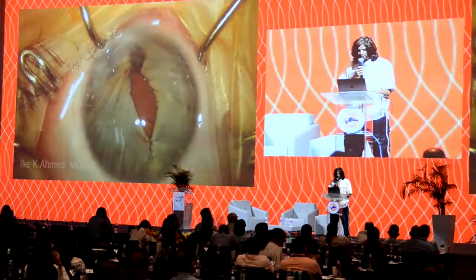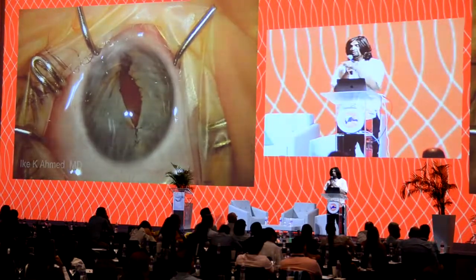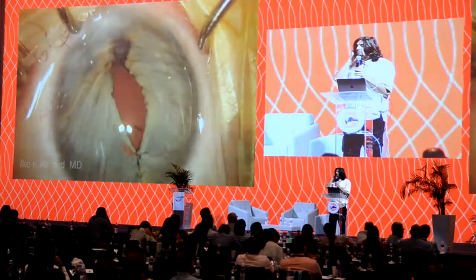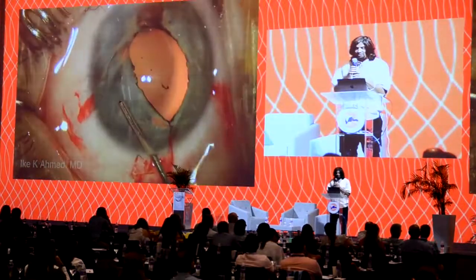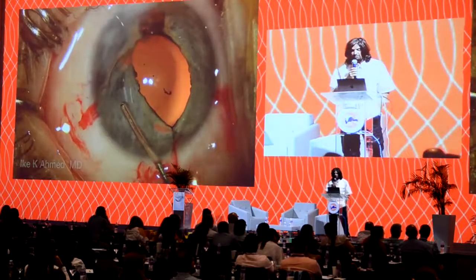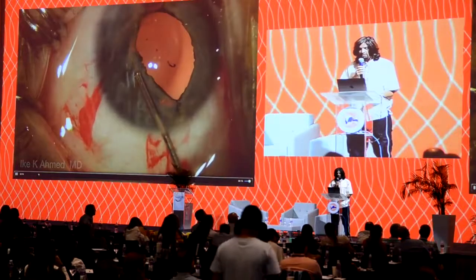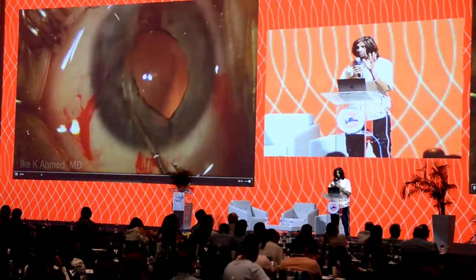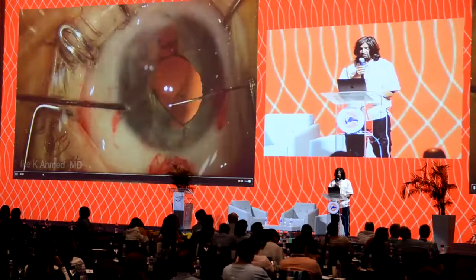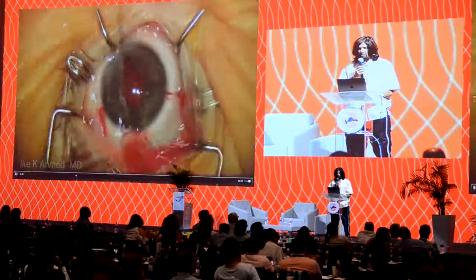And sometimes we have to do some pretty big manipulations. I know the Shields, this patient actually had iris tumor treatment by Jerry and Carol Shields. I know they had to leave, but this was a patient that was sent up to us, a young patient. We're going to do a lot of manipulation here. This patient is phakic, so yes, probably cataract in the future, but still good accommodation, good vision. Some cautery. I'm just going to fast forward again.